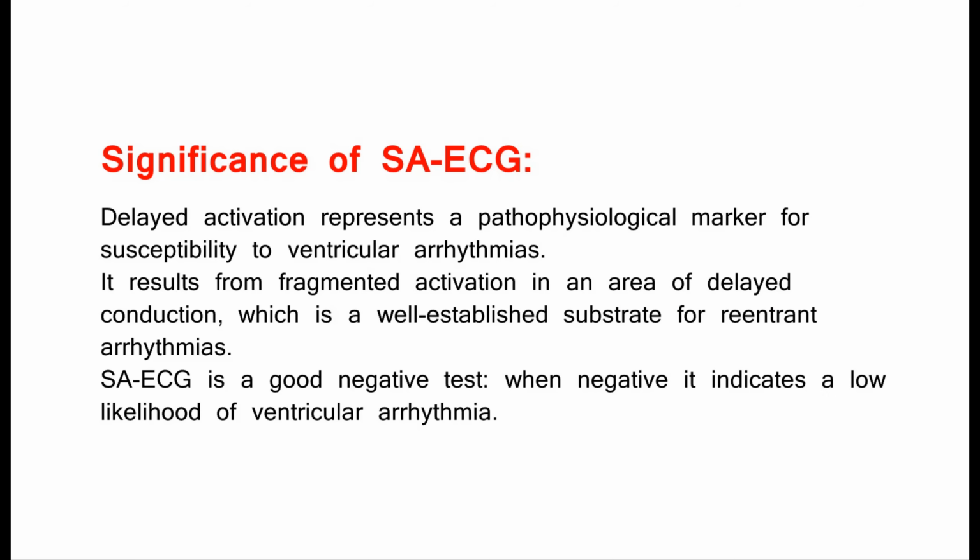Significance of SAECG. Delayed activation represents a pathophysiological marker for susceptibility to ventricular arrhythmias. It results from fragmented activation in an area of delayed conduction, which is a well-established substrate for reentrant arrhythmias. SAECG is a good negative test. When negative, it indicates a low likelihood of ventricular arrhythmia.